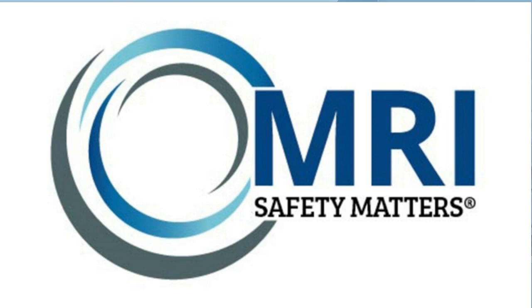And most importantly, I would say, having worked in a joint control room with CT, having as few distractions as possible. Again, the design when you have a joint control room, whether it's 2 MR scanners back to back or MR and CT, it can make it really difficult because there's so many distractions for staff, and a lot more staff, especially for CT if an emergency patient arrives. Emergency staff might insist on being in the control room or the joint controlled access area. If you had good design and you had radiographers at the beginning designing departments as well, or being involved in that with safety experts, then hopefully we could get designs in place that work for everyone.